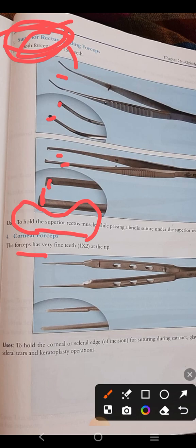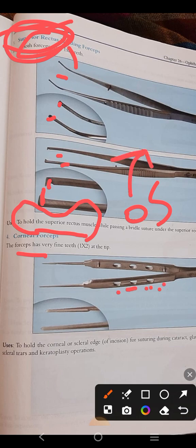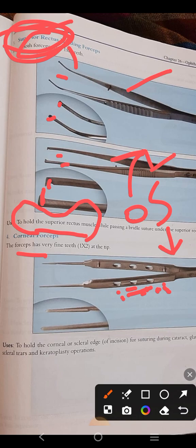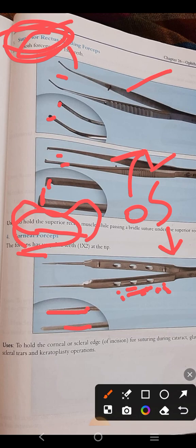The corneal forceps — since 'cornea' contains the letter O, remember the mnemonic 'OS': O for openings, S for single fine teeth. Openings are present in its limbs — the forceps covered before had no openings in their limbs, but here openings are present. A single fine tooth can be seen at its tip in the zoomed picture. It is also known as corneoscleral forceps and is used for holding the corneal or scleral edges during cataract surgery, glaucoma surgery, or keratoplasty operations.